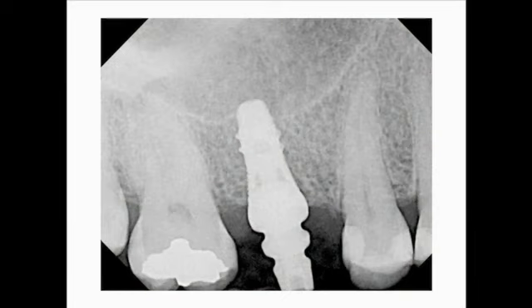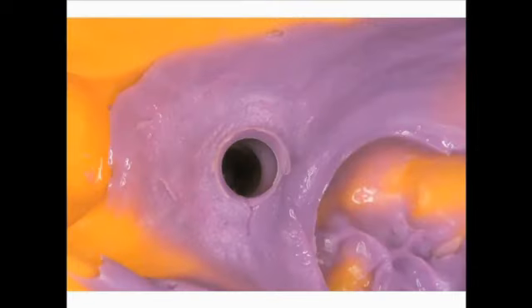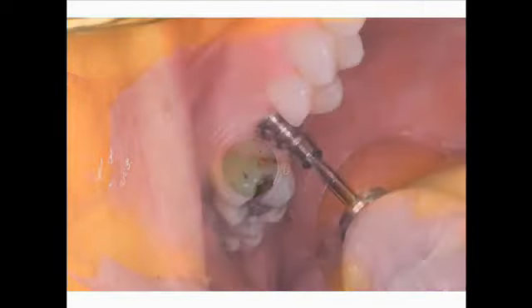A radiograph is taken to ensure a complete seat of the impression coping. This is a mandatory protocol procedure to ensure that the impression coping engages the implant completely. You can't have any separation or black lines between the impression coping and the implant. Polysiloxane impression is made with light and heavy body materials. Note the clean contours of the impression. The impression coping must be retained properly in the impression to ensure a proper abutment and crown fabrication. There's no voids in this area.